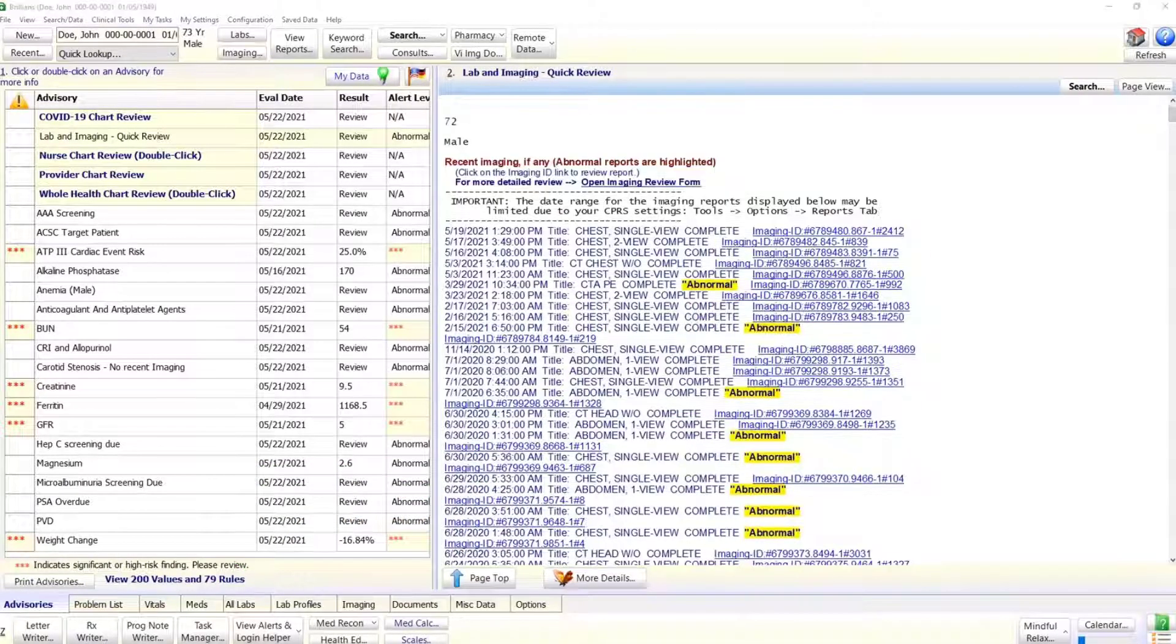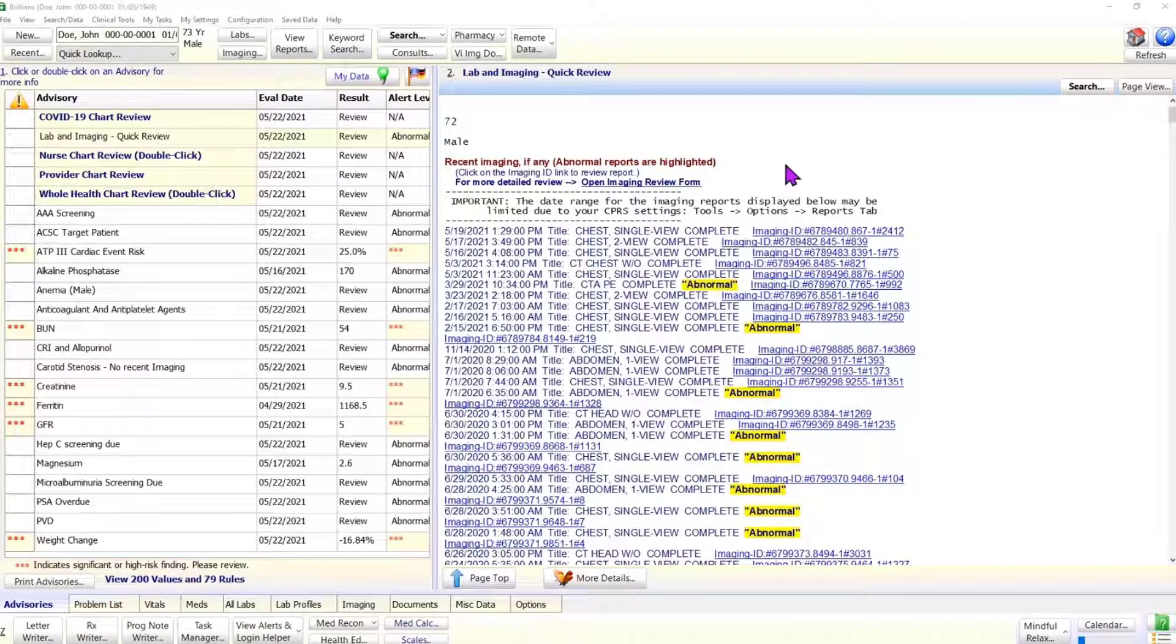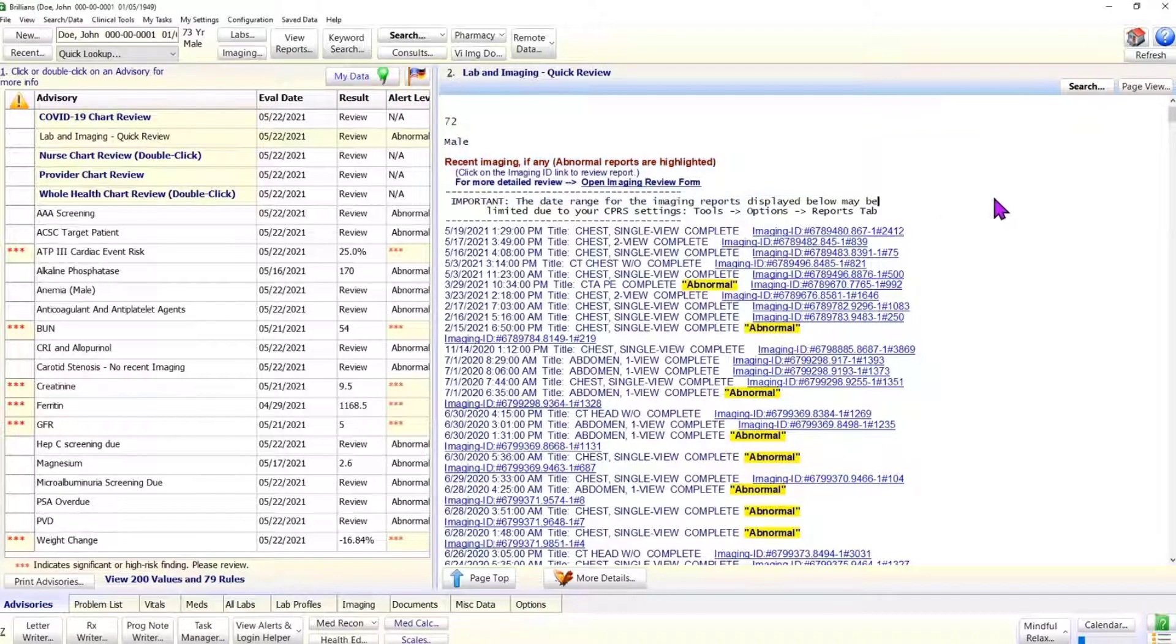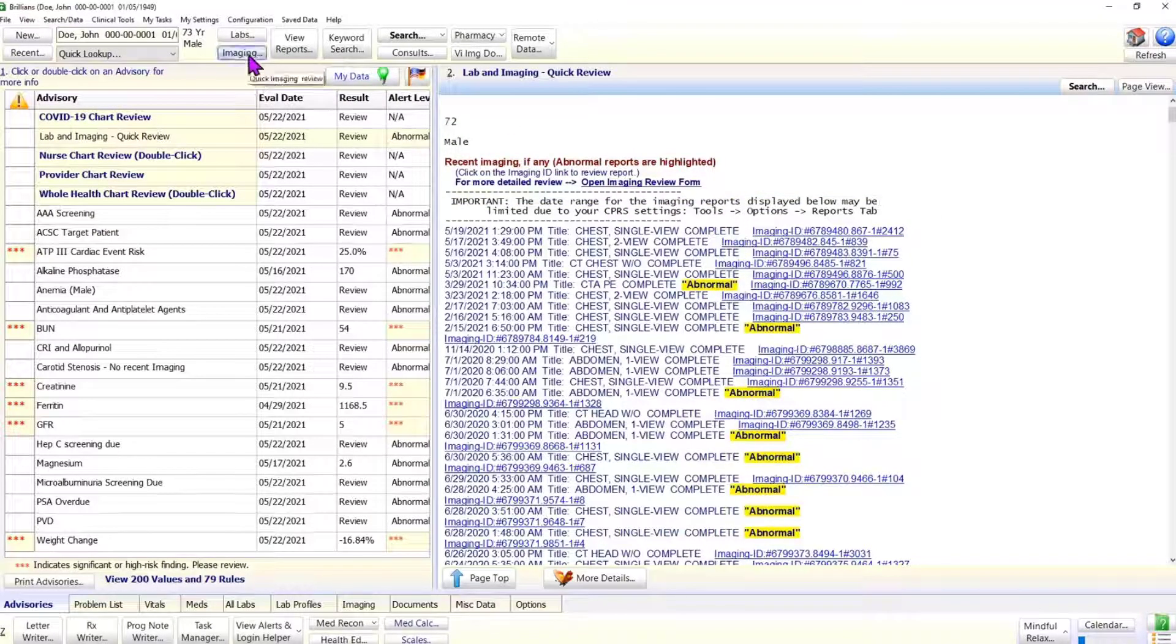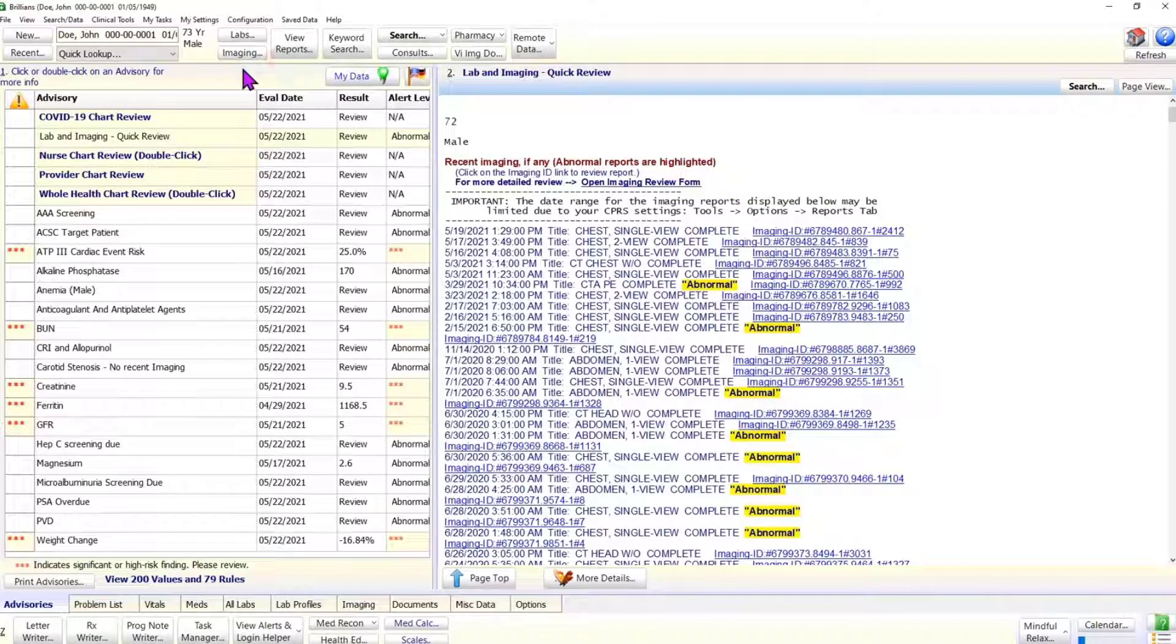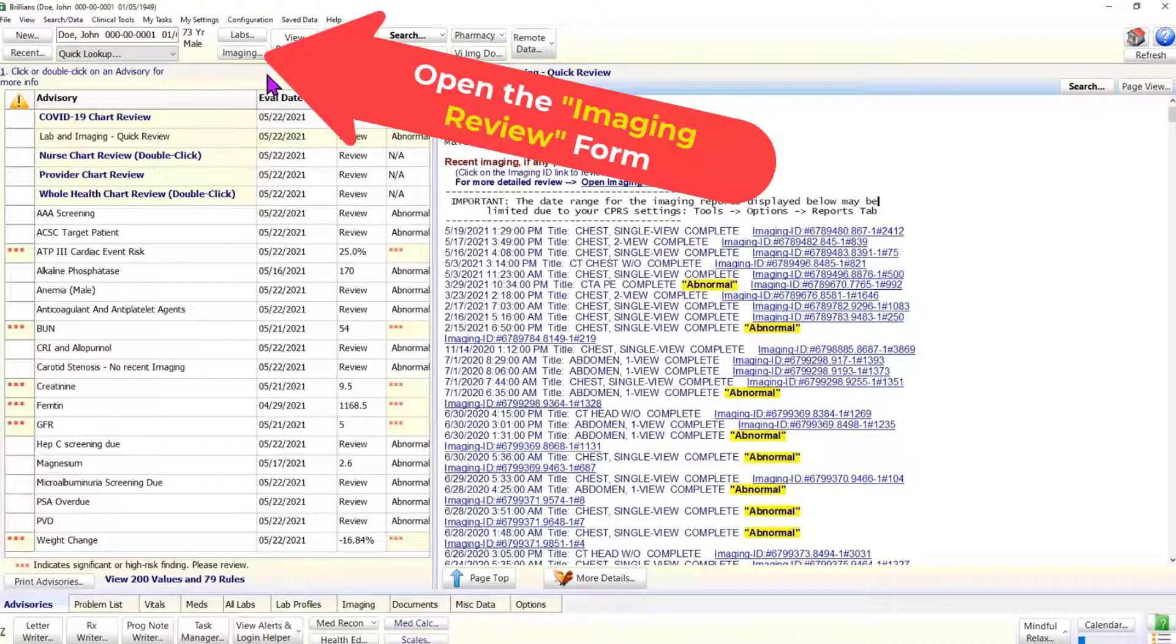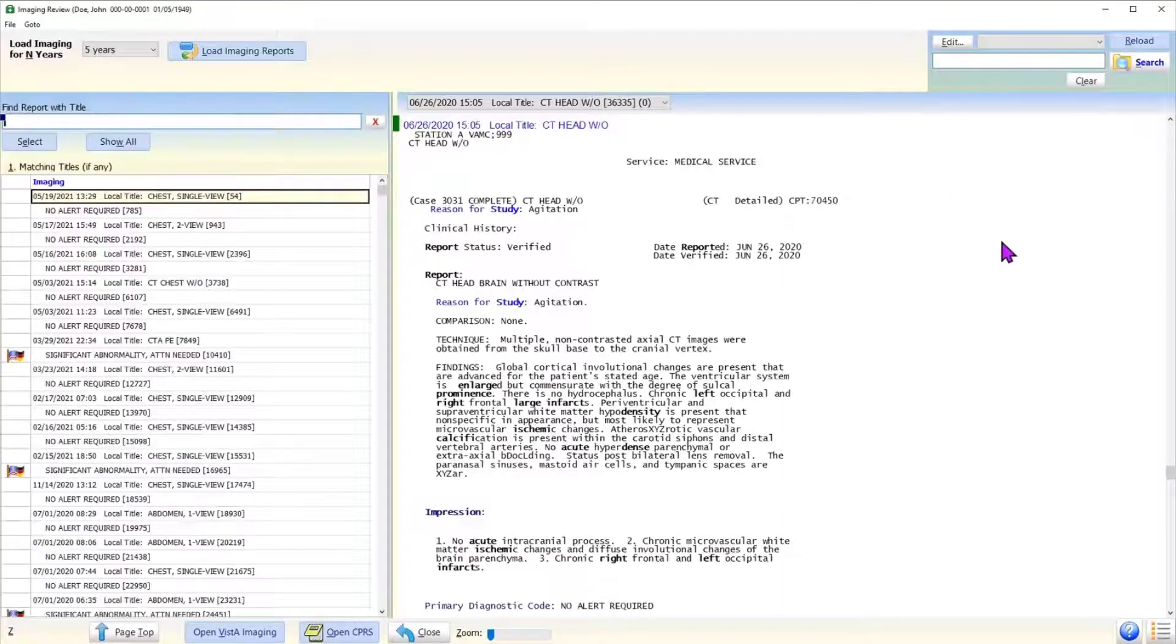In addition to the quick imaging review on the advisories page, Brilliance includes a dedicated form to easily review and search the imaging reports in the desired date range. To open the imaging review form, click on the imaging button on the top panel. Brilliance loads and displays the imaging reports list and their full text.